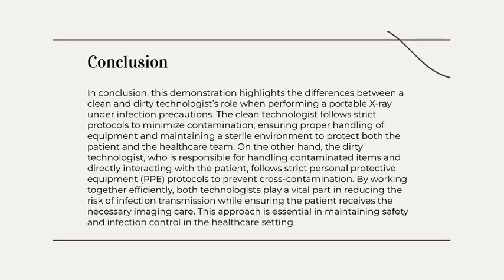In conclusion, this demonstration highlights the differences between a clean and dirty technologist role when performing a portable X-ray under infection precautions. The clean technologist follows strict protocols to minimize contamination, ensuring proper handling of equipment, and maintaining a sterile field to protect both the patient and healthcare team.